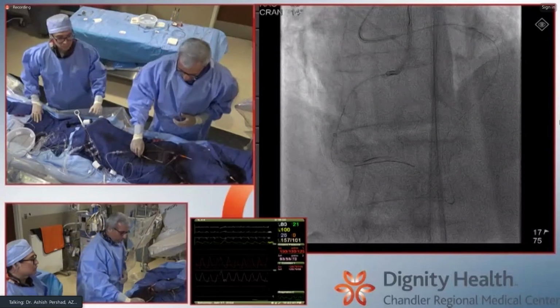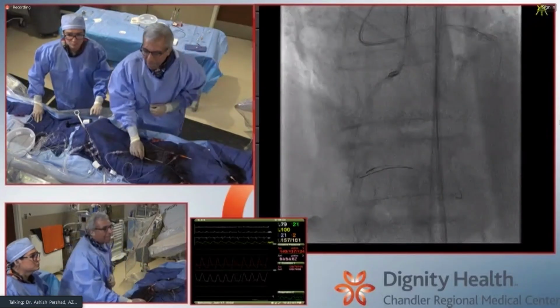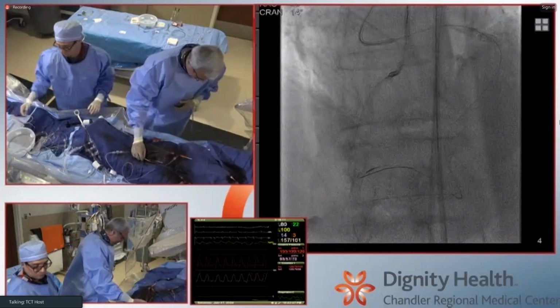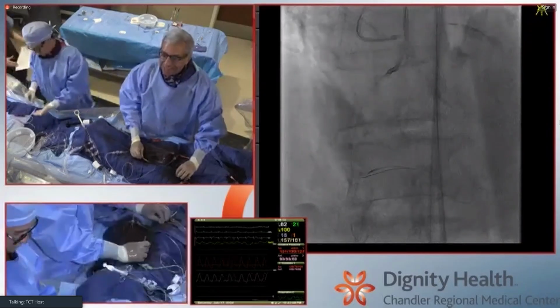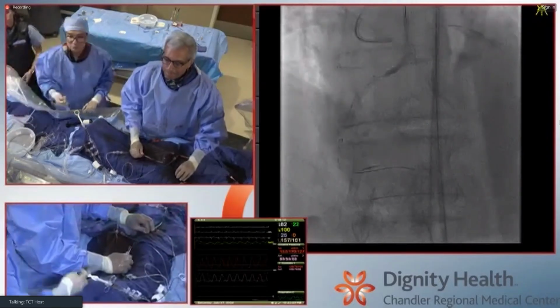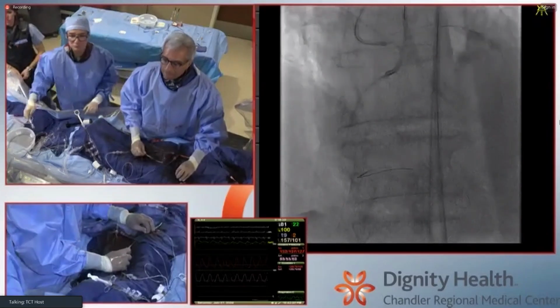Okay. That was your Pilot 200 that you had retrograde, right? Yeah, that was a dinged up Pilot 200. It's the dinged up Pilot, right? But that often works, doesn't it? Even the Mongo, it often works, right? Because you've just got a decent sized space, and if you make the right connection, you're done.